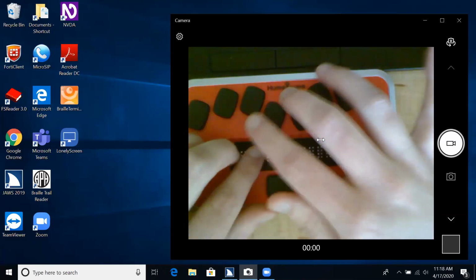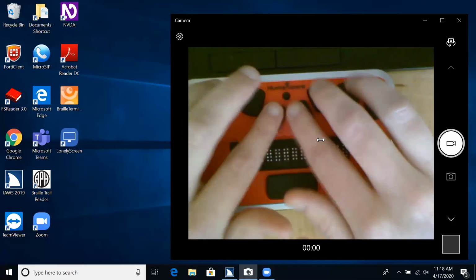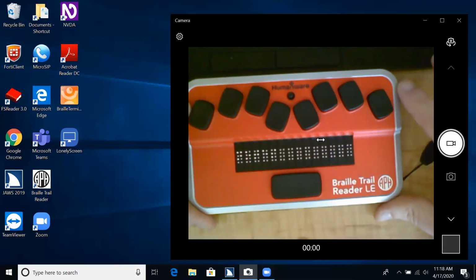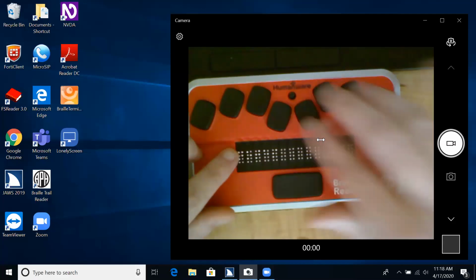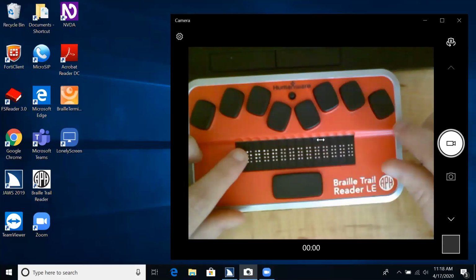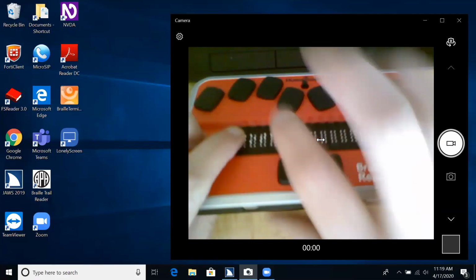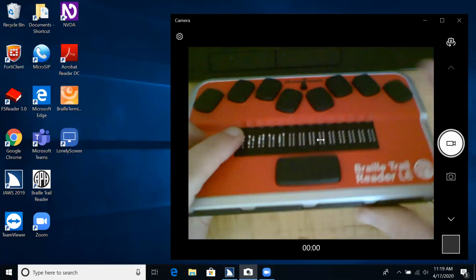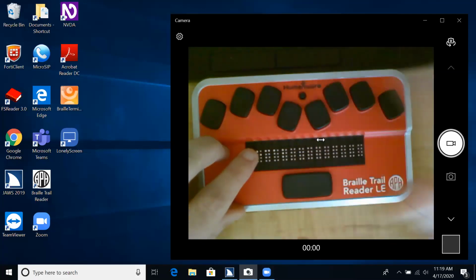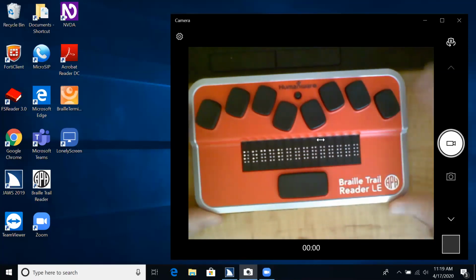The easiest way would be when I'm on that top level, right? I hit 1, 2, 3, 4, 5, 6 and space. I can simply press the letter N and I will read Notes on my Braille display. And then I can press Enter. And again, Enter being the key that is your right pinky, the furthest right on your Braille keyboard. I could either press Enter, or I could use one of those cursor router sensors, right, to activate the notes option, or I could press in on my joystick. So again, multiple ways. There's no right or wrong way to do this, just multiple ways of moving around.